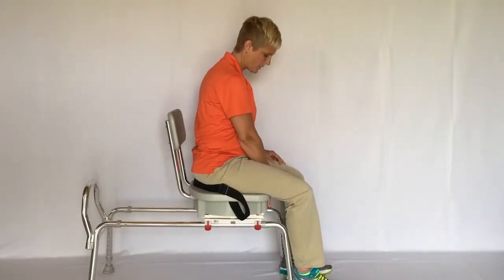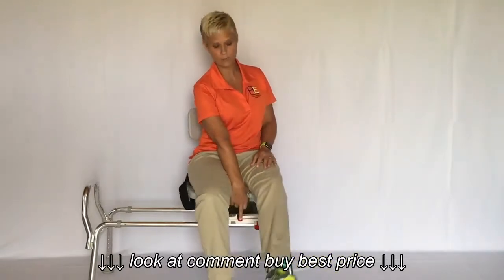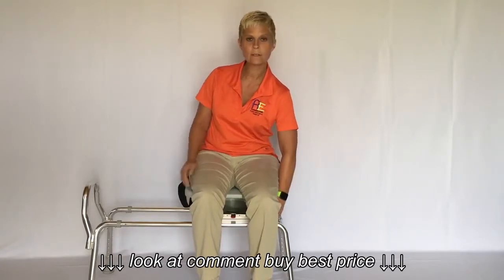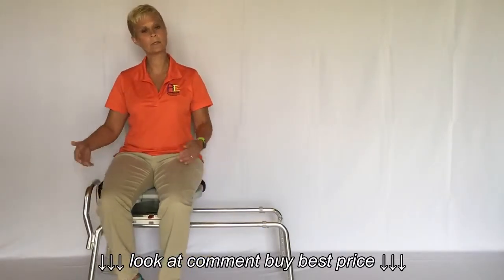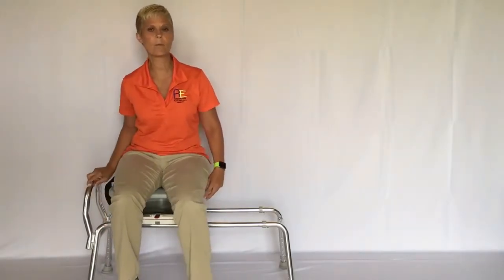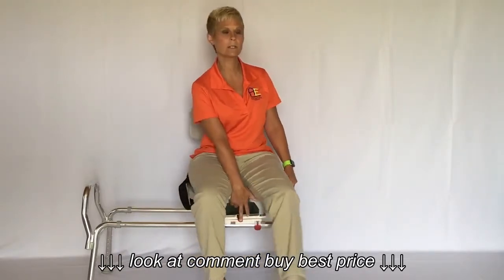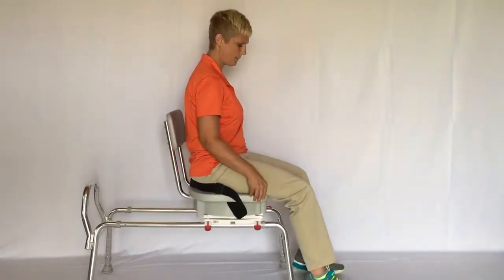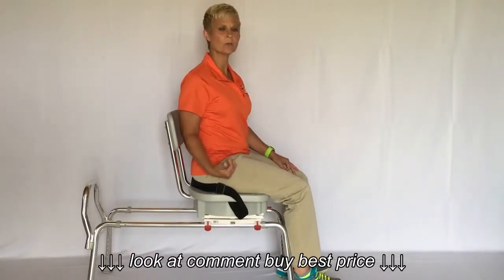Then I'm going to turn using the swivel lever, place my feet inside the tub or shower, and lock it into position. I use the little lever to release the button so the seat slides. I slide right down the carriage and you hear it lock into place on the other side. Then press the lever, slide back down the carriage, it locks in. Use the swivel seat lever, turn to the side, and it locks at 90 degrees so I can get out of the tub. That's how you use this.